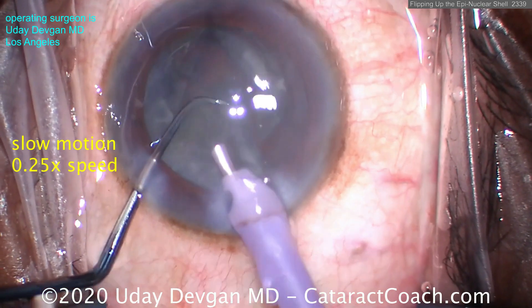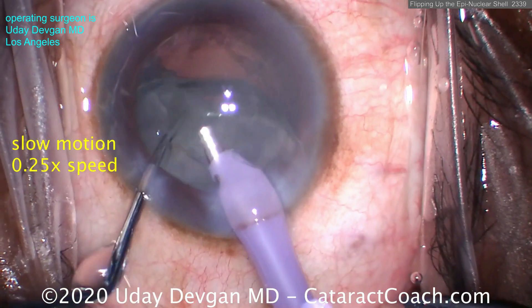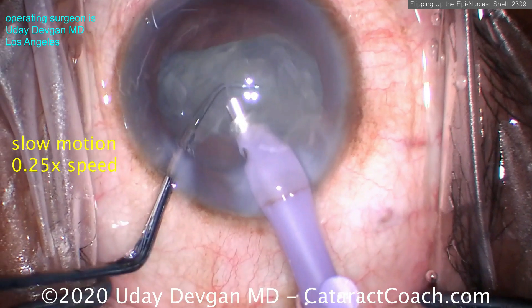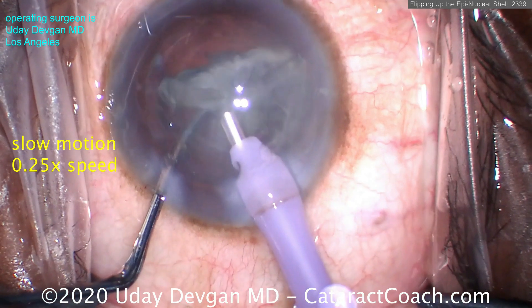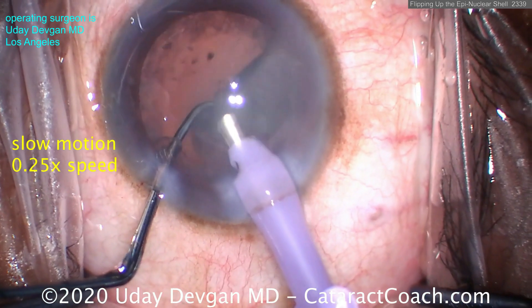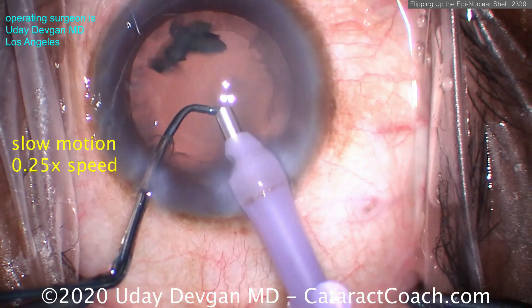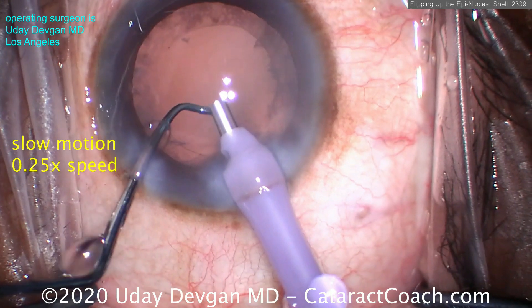Once I'm getting a good grab, the chopper will push — grab with just vacuum, let the chopper push it — that gets it out of the bag and makes it so easy. That's the epinuclear flip technique. At this point it's pretty easy: just vacuum it all down, aspirate it. Again, very little or no phaco power — just vacuum.